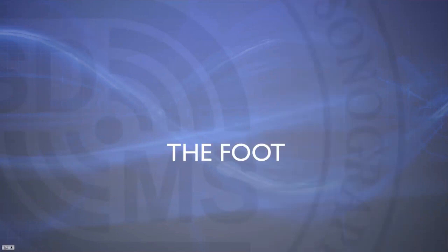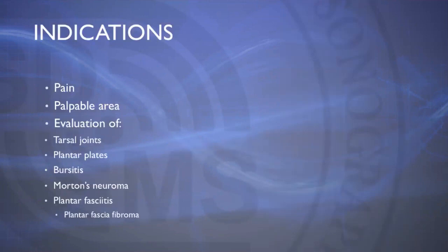Moving on now to anatomy of the foot. Indications are pain, palpable area, an evaluation of the tarsal joints, plantar plates, bursitis, Morton's neuroma, plantar fasciitis, and looking also for plantar fascia fibromas.